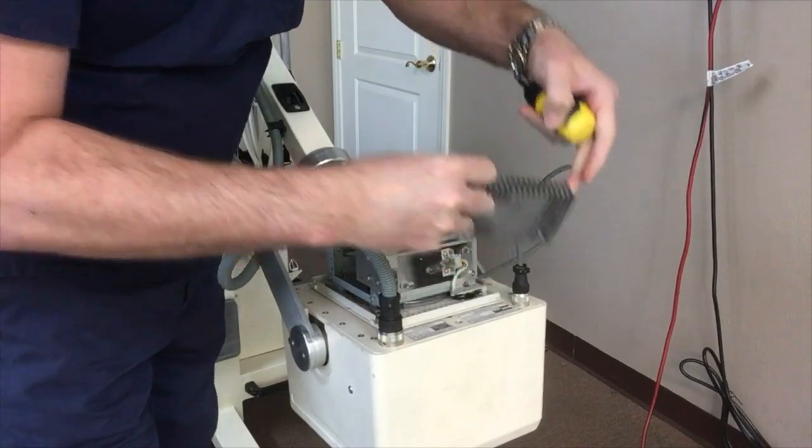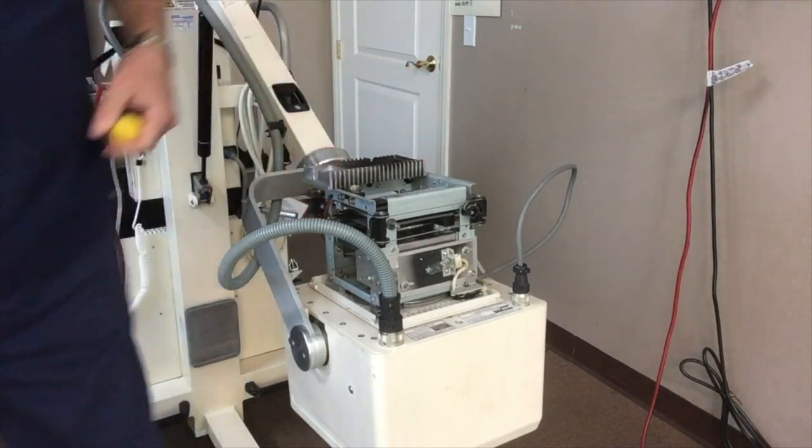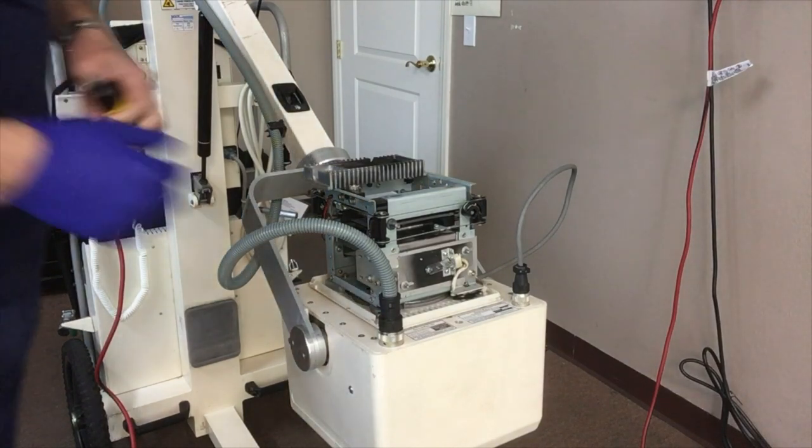Once you remove the heat sink, there's the bulb. When handling the bulb, it's a good idea to wear rubber gloves — you don't want to get the oils from your hands on the bulb.